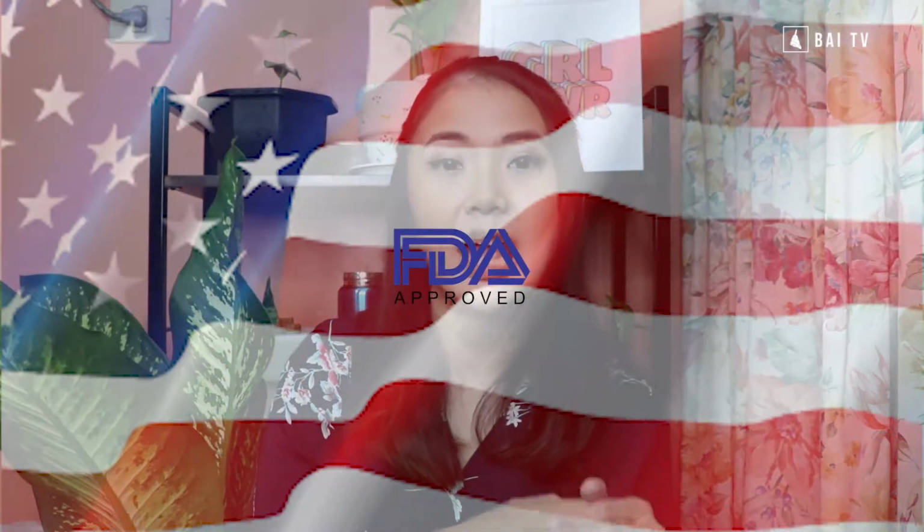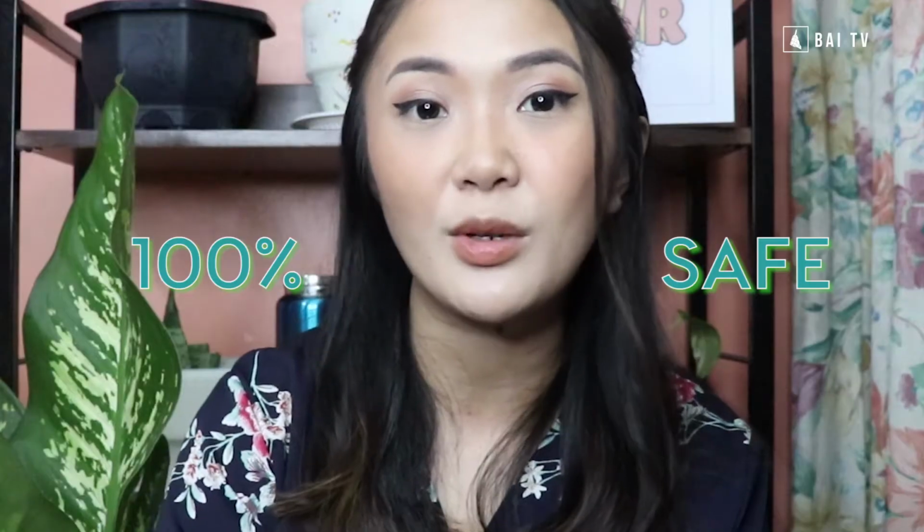As a menstrual cup user and advocate for over a year now, I highly suggest using US FDA approved menstrual cups because these cups have actually been tested and approved by the FDA to be used for prolonged periods of time. If I'm going to be wearing a cup for over 12 hours, I want to make sure that the products I'm using are 100% safe. I want something that's FDA approved. Unfortunately, our local FDA does not approve menstrual cups. So until then, I'm gonna have to stick to products that are US FDA approved. At the end of the day, I have to choose what's best for me.